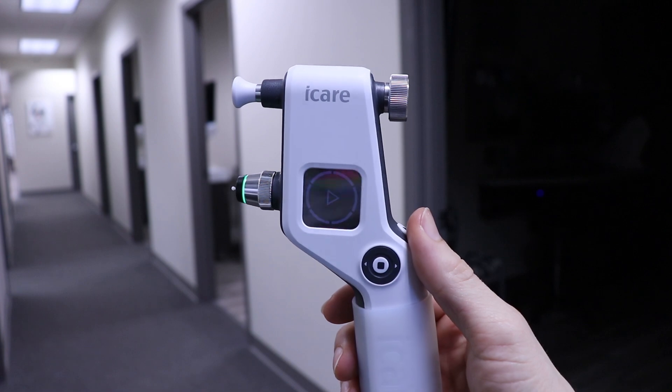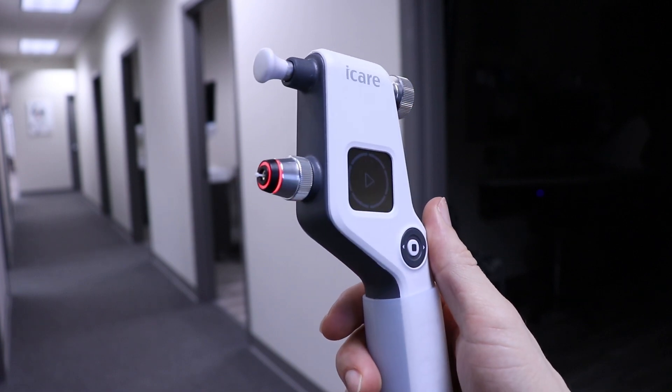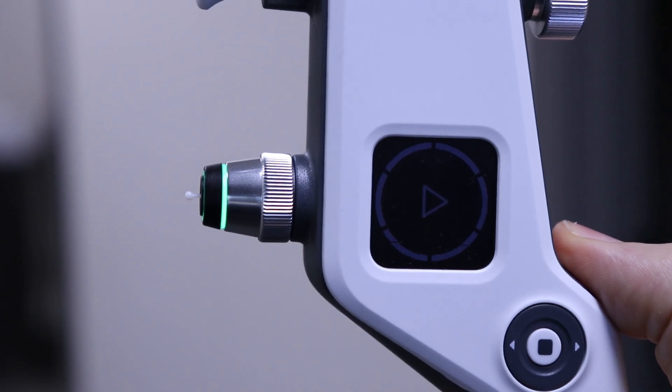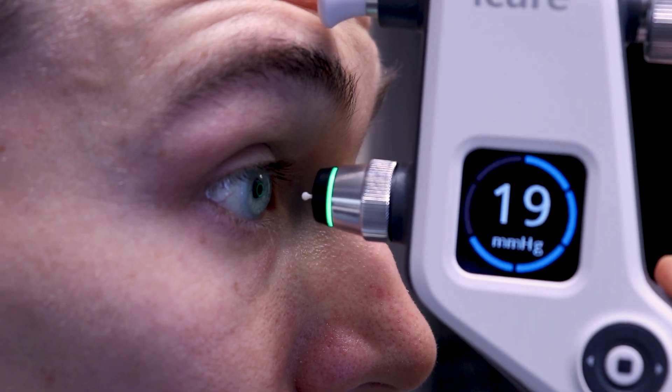Another one I really like, especially for screening and routine exams, is called the iCare. I have no financial interest in any of these instruments or the companies that make them. The iCare is a newer instrument that's very gentle — it has a rounded plastic probe that reaches out and just barely touches the eye, but it's so quick and gentle that you really don't feel it. It kind of tickles your eyelashes if you blink halfway through, but it only takes a few seconds and doesn't require eye drops. I love it.